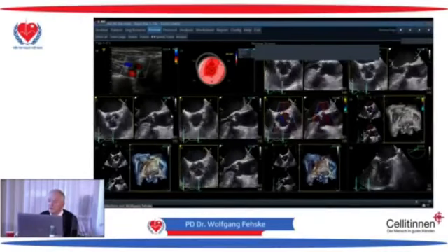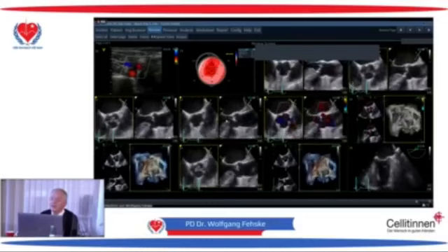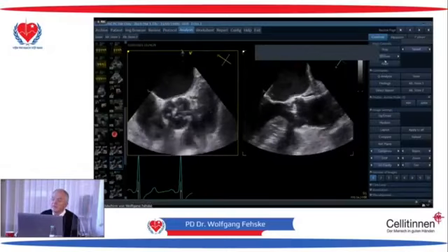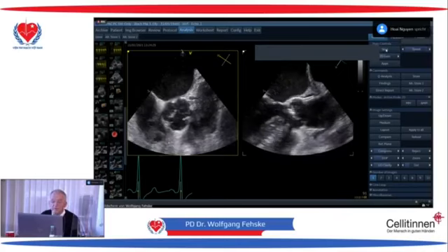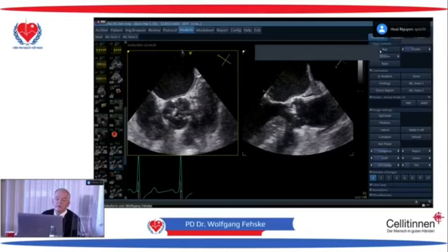The surgeon, or no, I never go with. You asked me. Huh? Let's say. No, I asked you about the calcification, the calcification assessment. Do you assess the calcification using 3D echo?